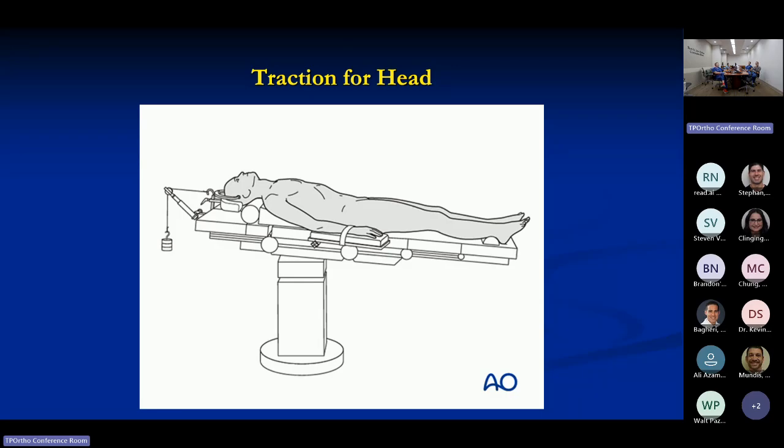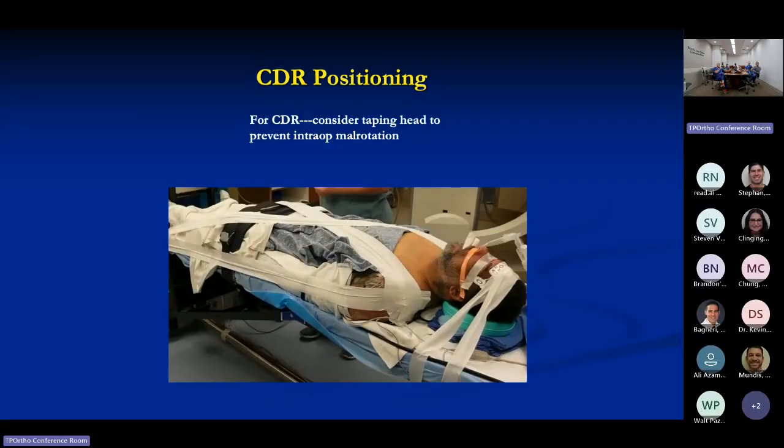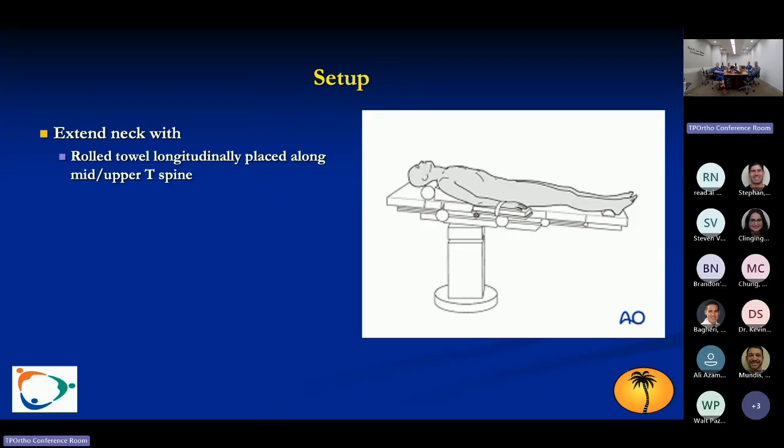If you have a deformity that you're trying to correct a little bit, that can also be helpful in pulling them out of some of the kyphosis if there's a little bit of flexibility to it. With disc replacement in particular, and some people do this even with ACDFs, you see the tape over the head that keeps the head from rolling. With CDRs, because it's so sensitive to positioning the implant, it's ideal to have the head really stationary and not roll on you in the middle of the case, which can malrotate or derotate the vertebrae relative to one another. You can see how taped is from shoulders down to the feet. So that's that constant traction that I tend not to like as much.